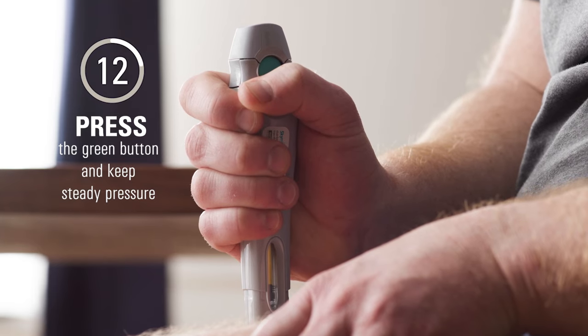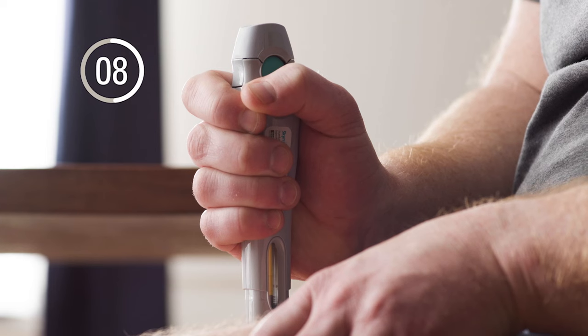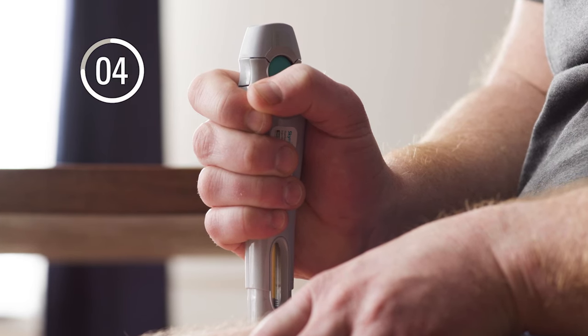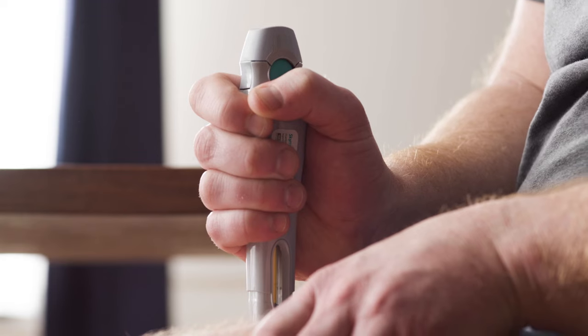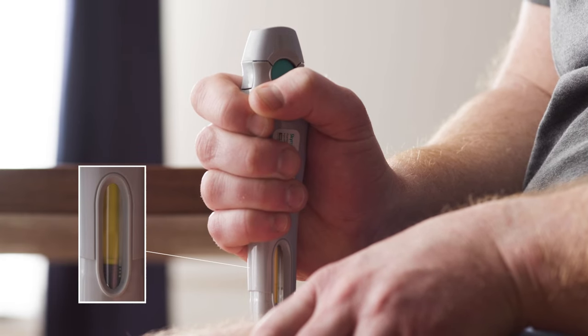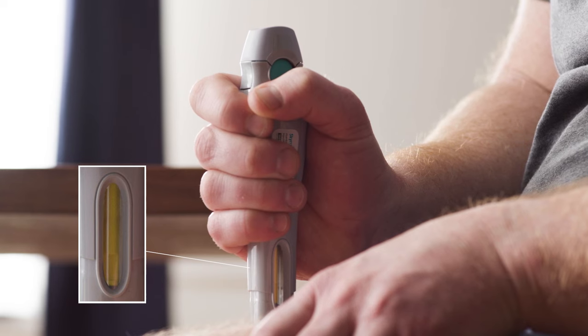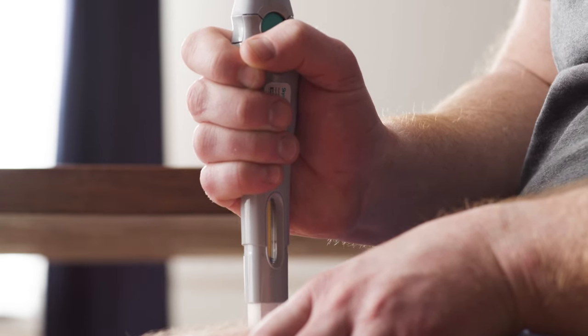Hold it like that for 15 seconds. I'll keep pushing the pen down against my skin until I hear a second click, or the yellow indicator has filled the inspection window. Either one signals the injection is complete. I check to make sure that the yellow indicator is fully down to be sure the injection is complete. Only then do I slowly pull the pen straight out from my skin.